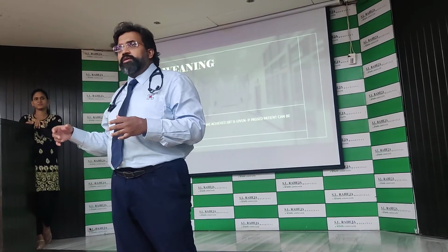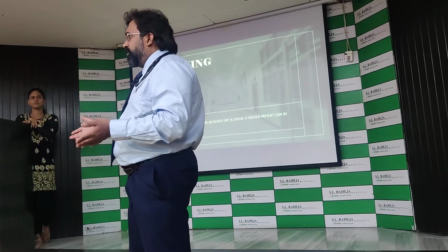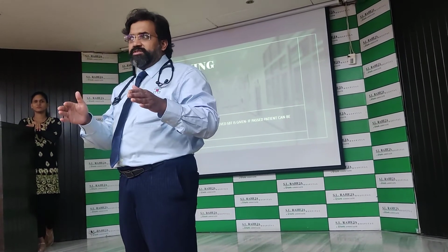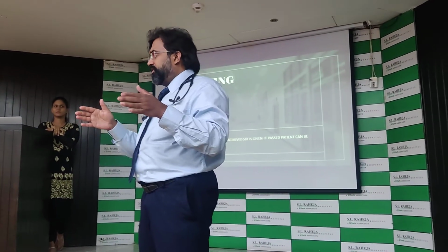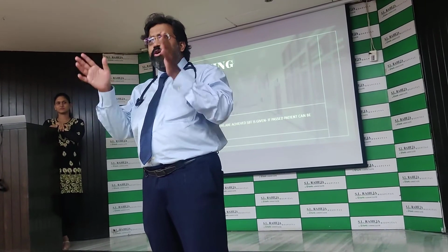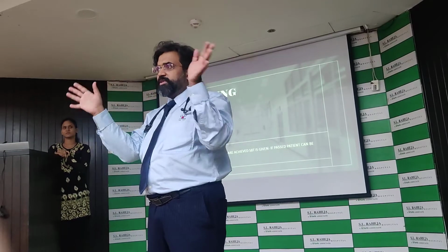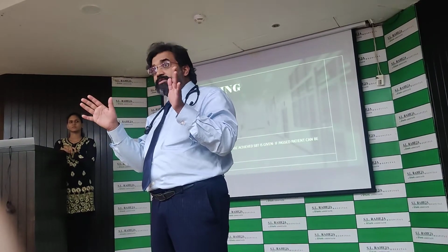What happens over here? Without you knowing, the ventilator picks up that this patient is taking a breath. And rather than giving the large tidal volume that he would otherwise receive, it still ventilates him in that box. So he gets a low tidal volume, he gets adequate pressure, and he's in that box. As time goes, slowly in that box you will see his spontaneous breathing was only 20%, then it becomes 40%, and then it becomes 100%. So once it becomes 100% on that breathing pattern, we now know that he's breathing fully.